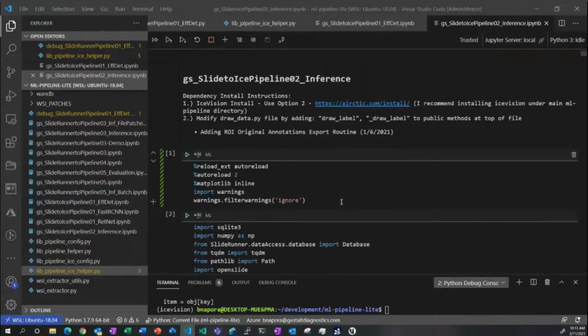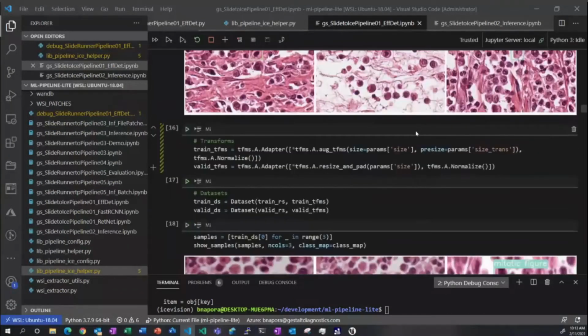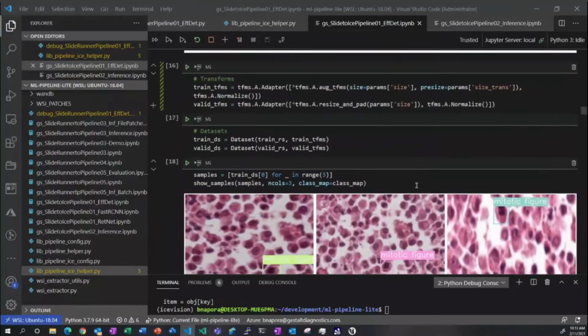So that might explain why you don't see them, because when you have boxes that are between 32 and 96 pixels, they are considered as a medium size, and the average precision for the medium size boxes is usually lower than the big ones.